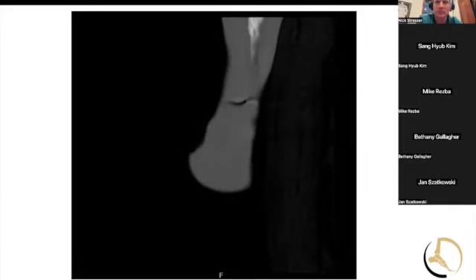From the back, maybe, right? Yeah, that'd be nice, but she'll be short after that, because you can't bone graft her in the front. I don't know. I would probably shorten her a little bit, so do it from the back, shorten her, and shorten the fibula.